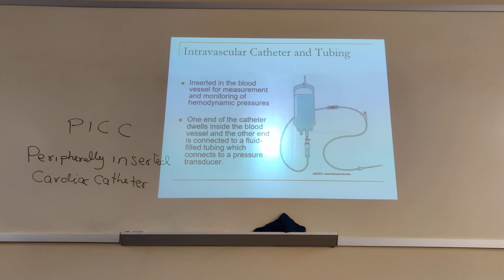If you get ready to put in an A-line, the respiratory therapist at Loveless can do it. I don't know whether there's any other hospital here that allows the respiratory therapist to do it, but if you work in Florida, respiratory therapists actually put in A-lines and monitor and manage them. So it's a little different from state to state. But I know Loveless can do that.